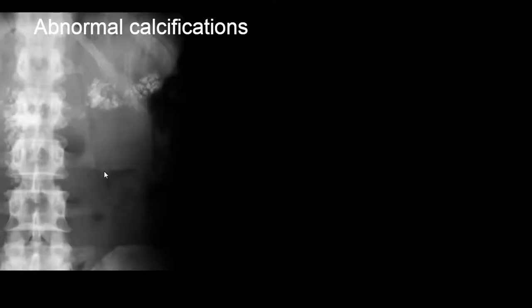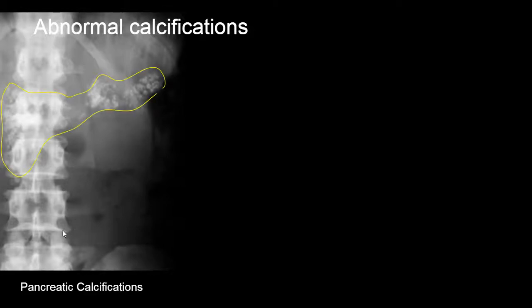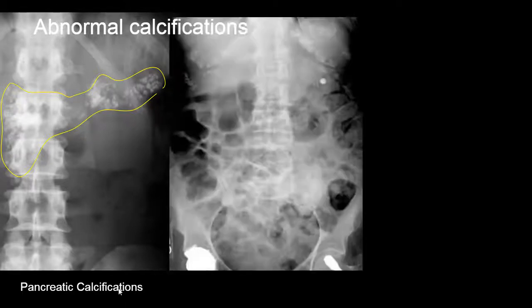Now let's talk about abnormal calcifications that we can see on radiographs. On this first radiograph we see abnormal calcifications centrally, and this is due to pancreatic calcifications from chronic pancreatitis.